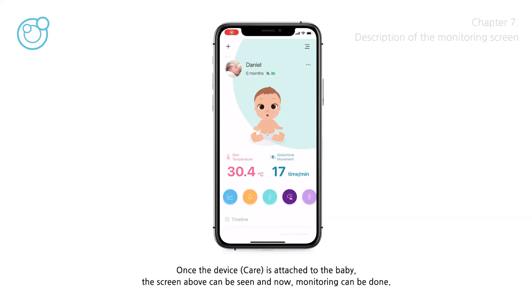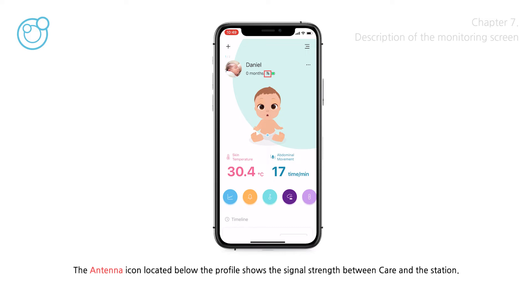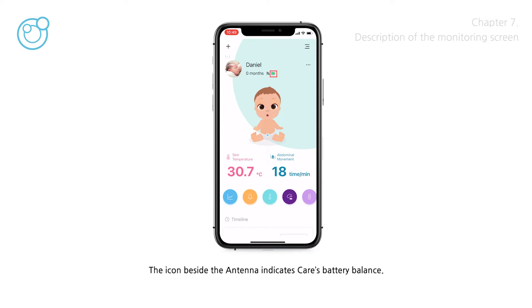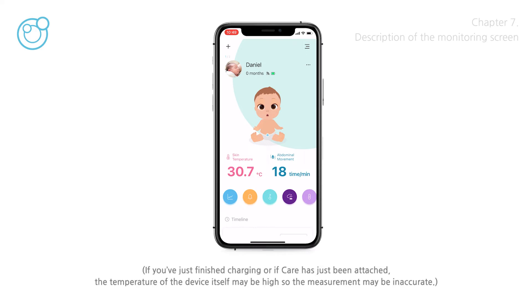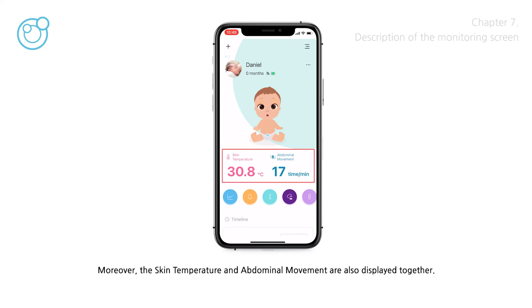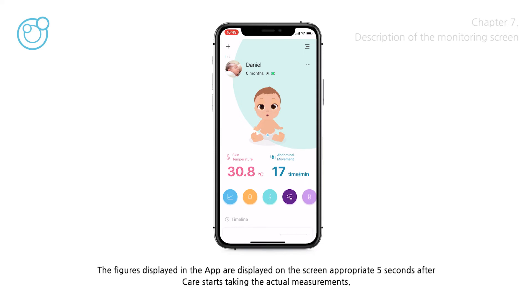Once the device is attached to the baby, monitoring can be done. The antenna icon located below the profile shows the signal strength between care and the station. If the signal strength is weak, maintain a close distance between the station and care. The icon beside the antenna indicates care's battery level — if the battery is low, charge care. When care is attached to the baby, the character inside the screen reflects the current posture of the baby, and the skin temperature and abdominal movement are also displayed. The figures displayed in the app update approximately every 5 seconds after care starts taking measurements.